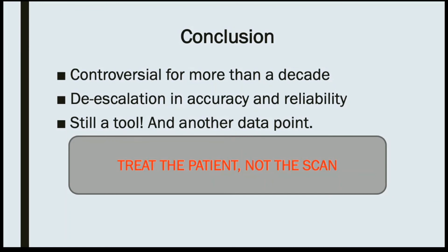Because when you look at a patient, you don't look at one blood result or just one lung listening or just one lung ultrasound. You need a lot of data points to make the picture and to fit into the picture. If you've got a patient that you think is hypotensive from a PE and you do the ultrasound, and that IVC is standing up massive, it fits in with your picture.